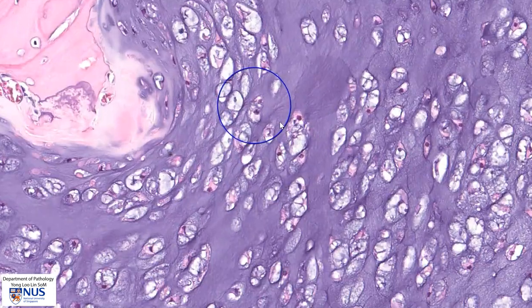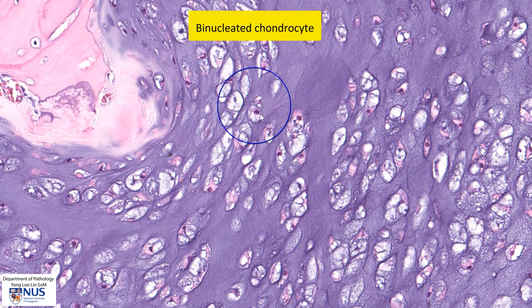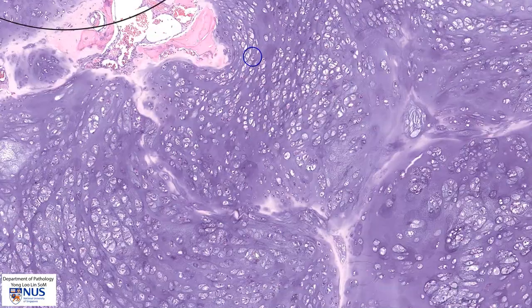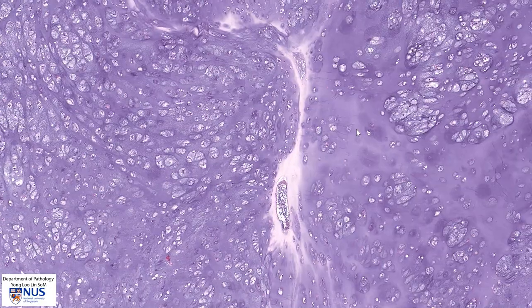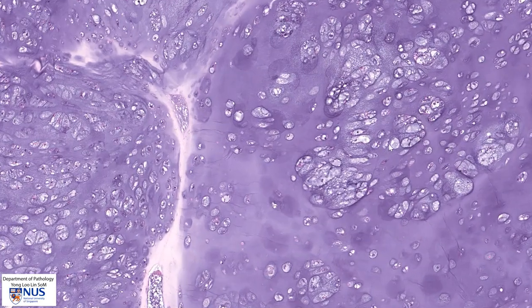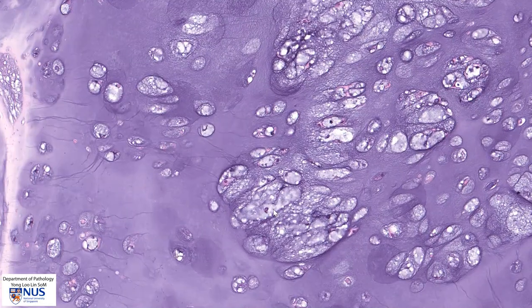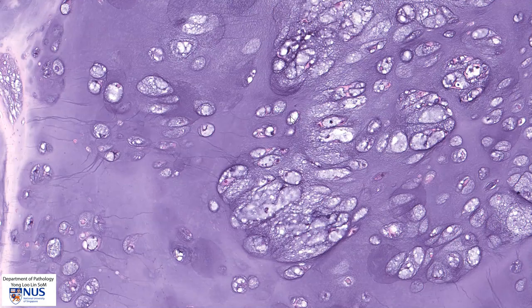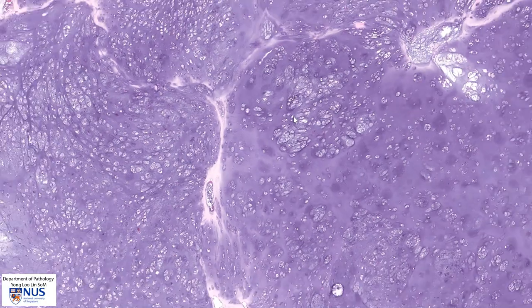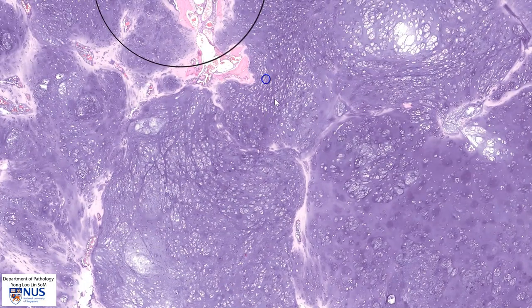In this area we also see another atypical feature which is that of a binucleated chondrocyte. There is some variability in the appearance of the nuclei — some of the cells are much larger and other cells are much smaller. Chondrosarcomas are graded according to cellularity, mitotic counts, as well as the degree of nuclear pleomorphism.